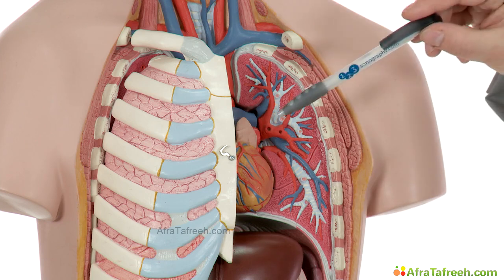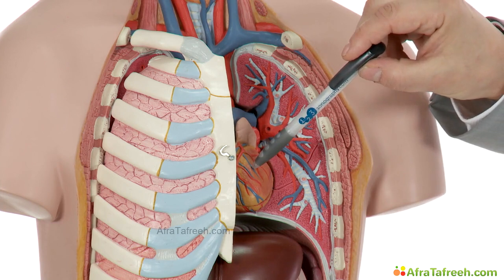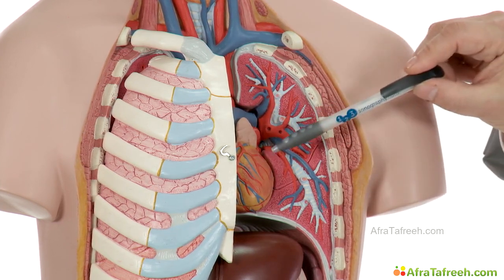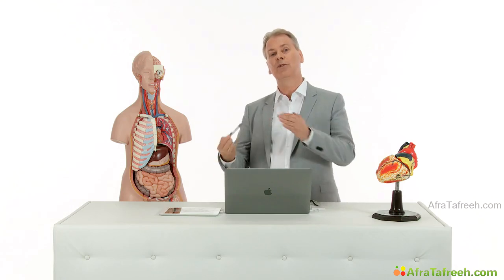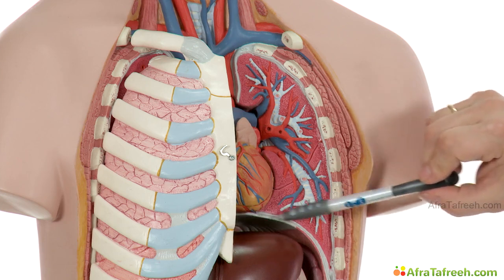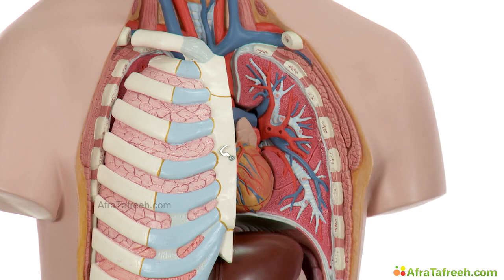If you point the ultrasound to the heart, the first structure you will see is the right ventricle because it lies ventral. Lateral is the left ventricle with the apex pointing lateral, but sometimes also almost towards the back. So the position of the apex can vary greatly. Below the heart is the diaphragm and the liver. These structures border the right ventricle and the inferior parts of the left ventricle.